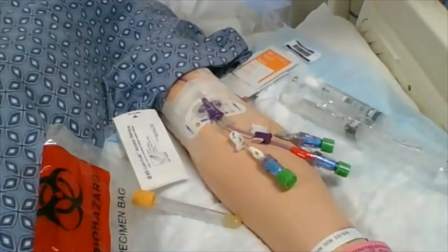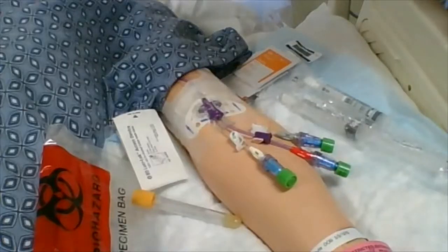Hi. Today we're going to go over drawing blood sampling from a PICC line. Let's begin.